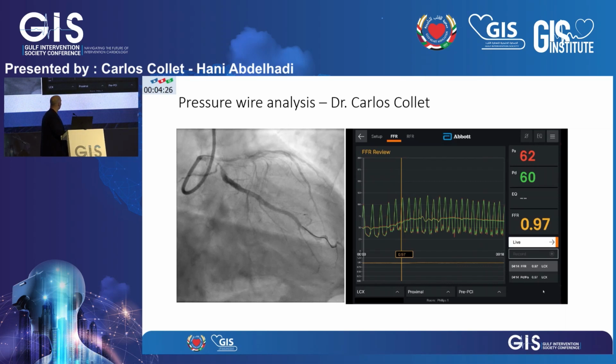Here, what I can see is a little bit far from me, but I can see it from here. There is a ventricularization of your aortic pressure waveform. I see it clearly overlapping with your pressure Y signal. And I also see the reason. Your guide is actually looking at the roof of your left main, and that is impacting your curve. So this FFR measurement, I think you should read it carefully. The way to solve this is very simple. You just take a little wire and you disengage the guide, you recheck that the morphology has changed, and now is the time to assess the FFR.